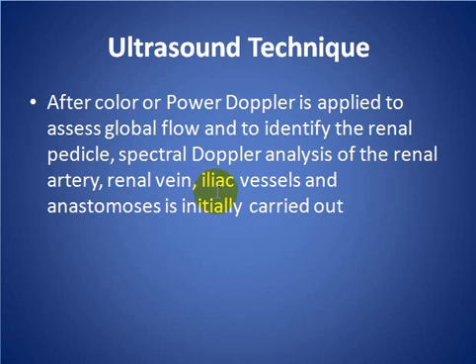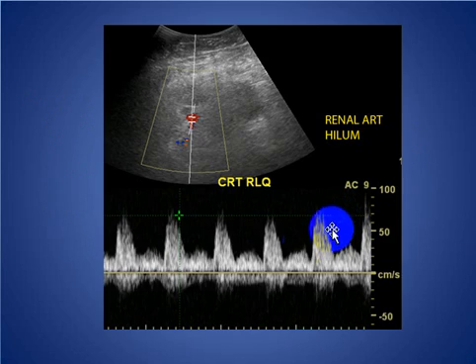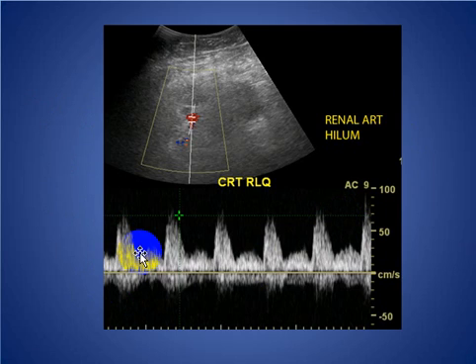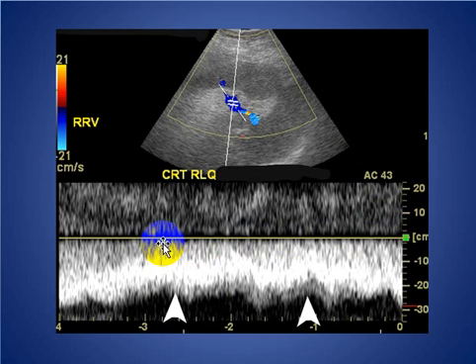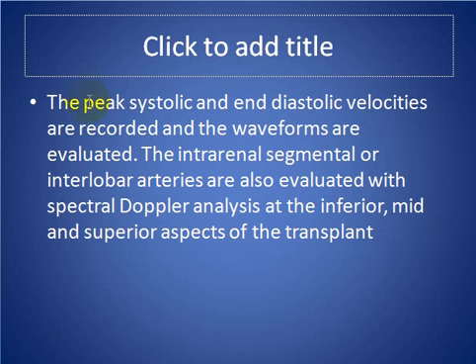After applying color and power Doppler to assess global flow, the renal vessels undergo spectral Doppler analysis of the renal artery, renal vein, and iliac vessels at the anastomosis. Here you can see a normal renal artery spectral Doppler waveform with normal diastolic flow, and the monophasic renal vein is patent. Peak systolic and end-diastolic velocities are recorded and the waveforms are evaluated.